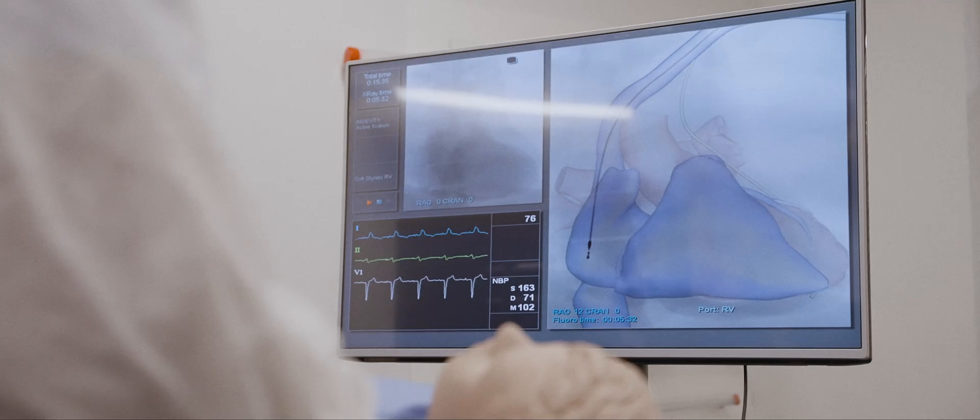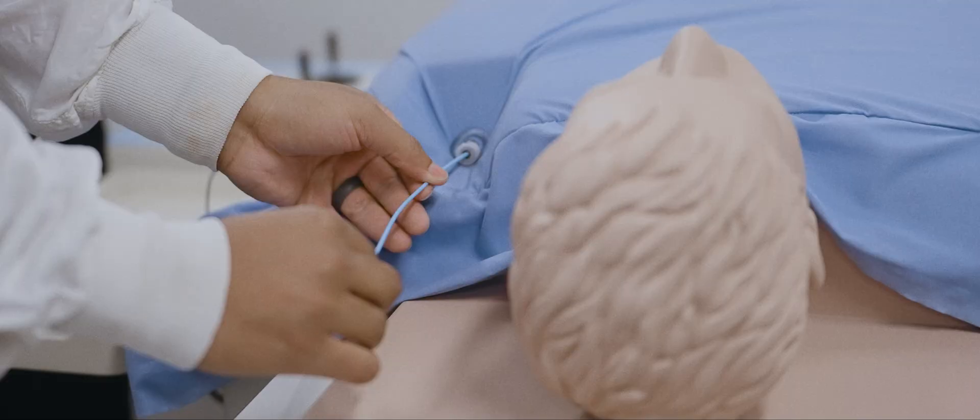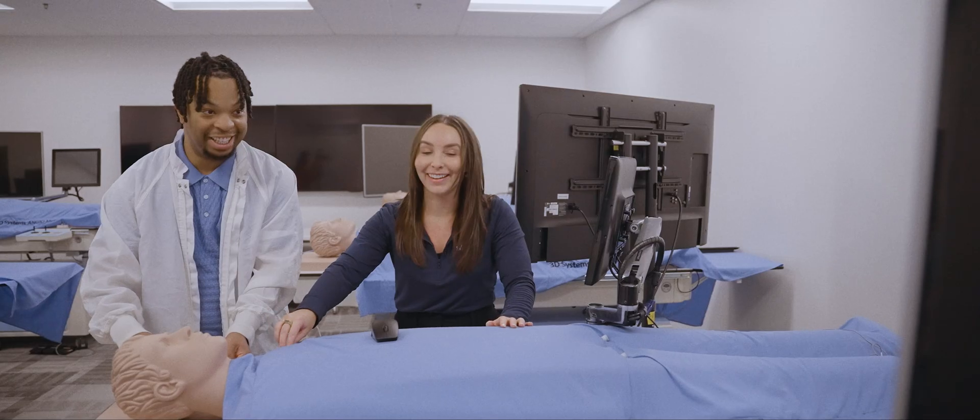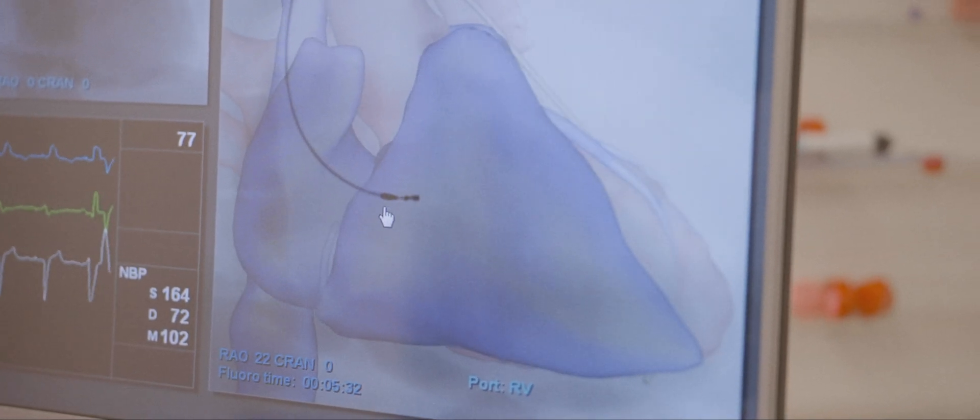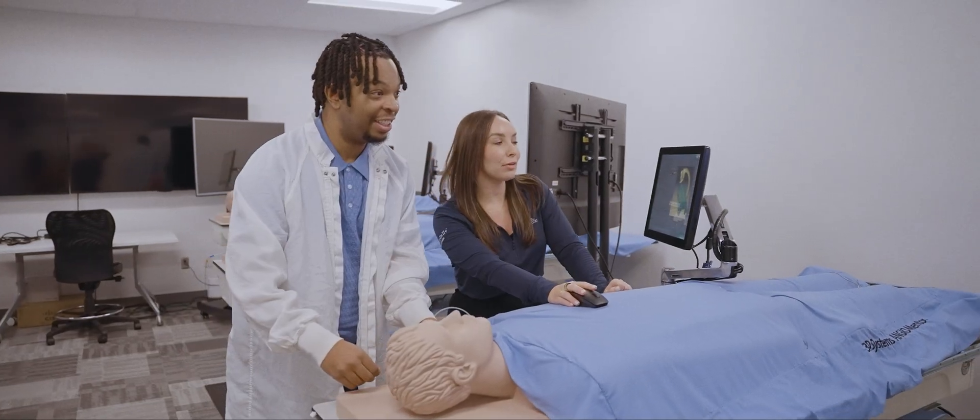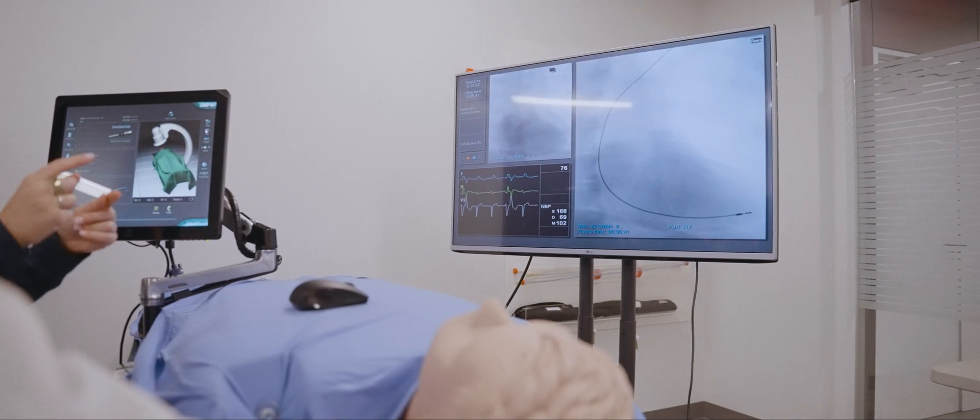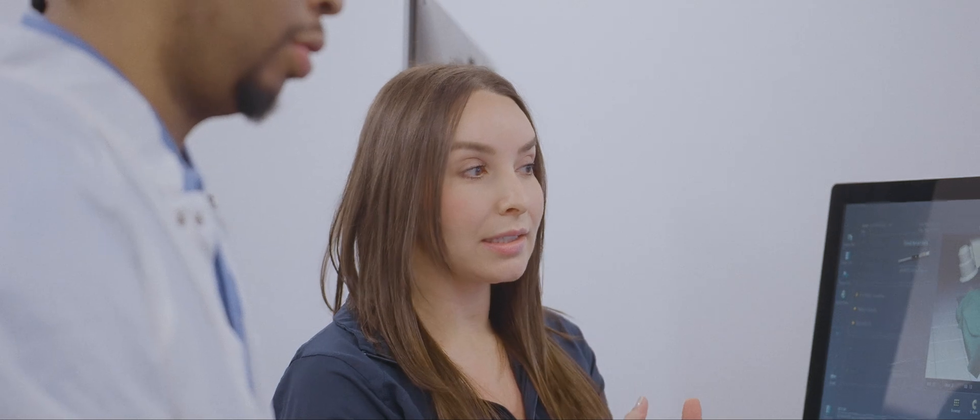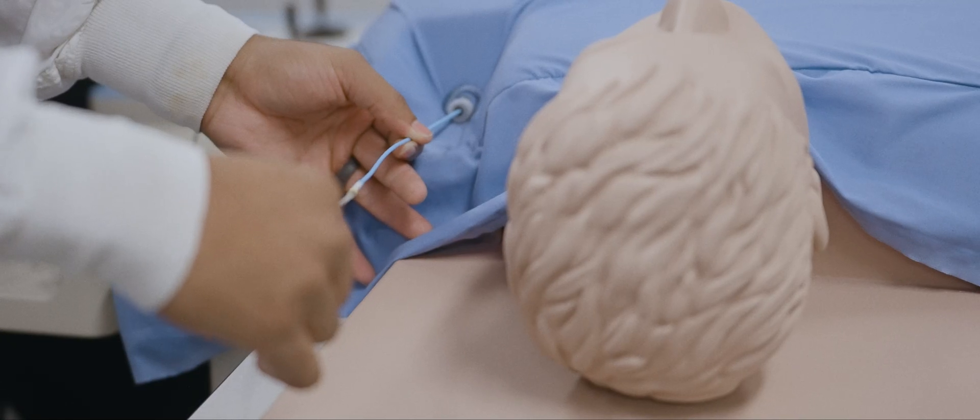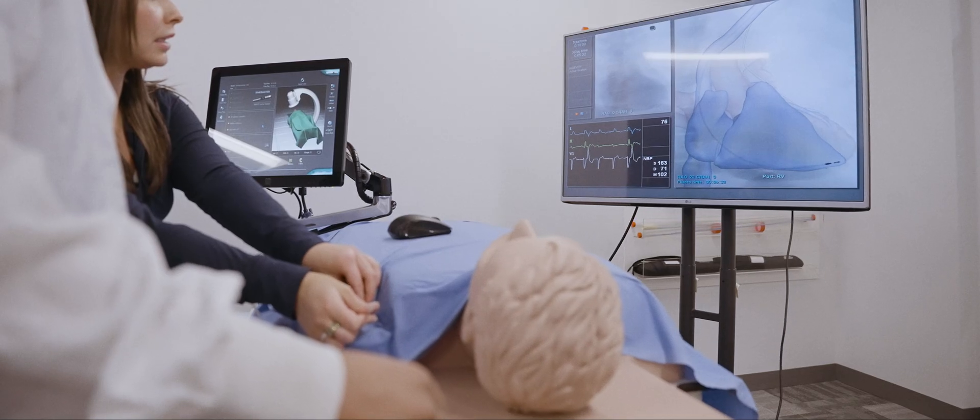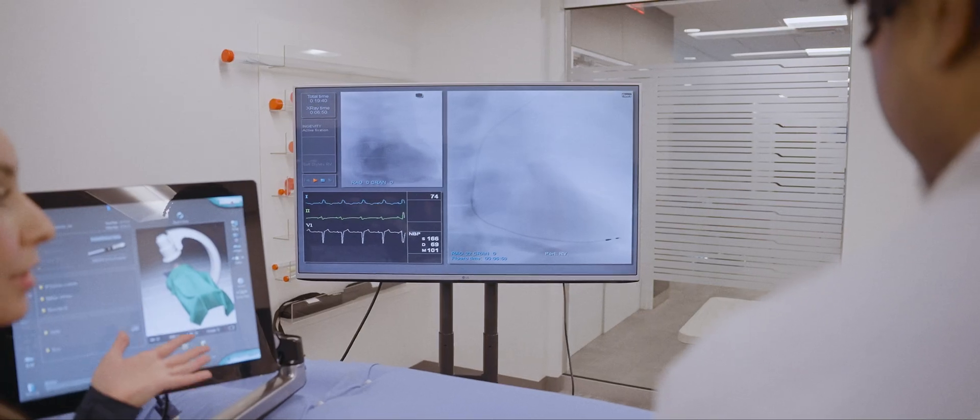We want to put this lead into the right ventricle. See it moving? You're not going to hurt anything here. Right there you go. Oh wow, that's exactly what we wanted. There's a tiny little screw that's how it fixates into the heart tissue. Pull that stylet out and you placed your first pacemaker lead.